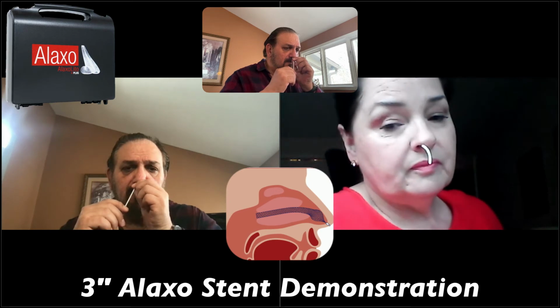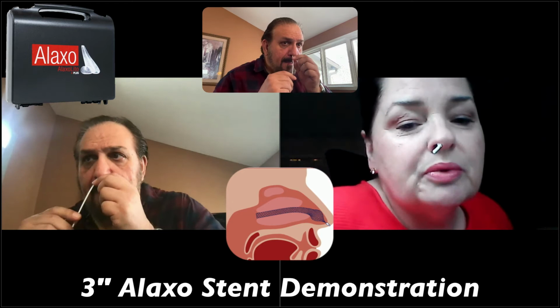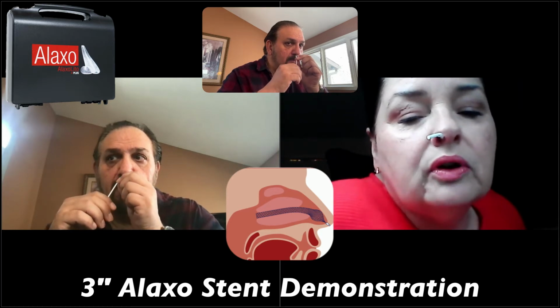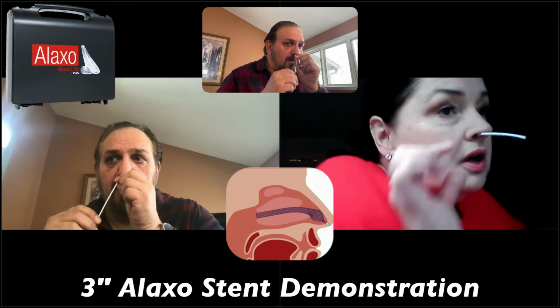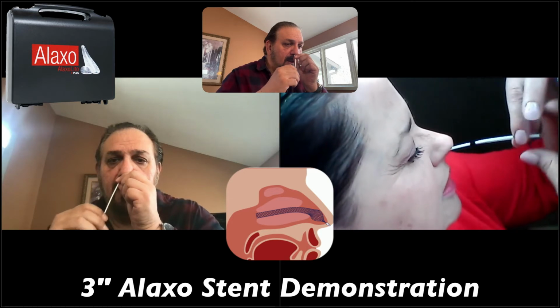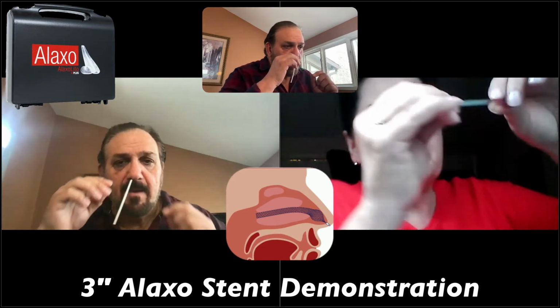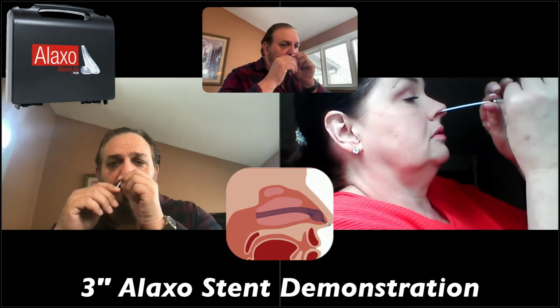The angle was right. So just pull that shaft back off, over top of the white tube, to deploy the stent. You're leaving the white there, and you're pulling the one over top of it, the introduction tube. You pull it wrong. You see how it slides? Remember, you're just sliding it off. I'm a little bit confused here. Okay. Do you remember this one that was on top of it? Okay, the clear one's on top.